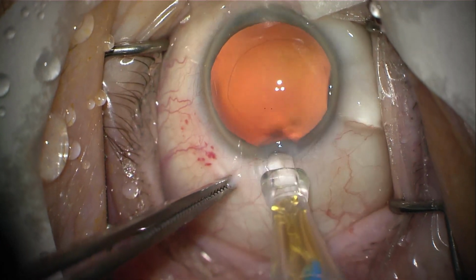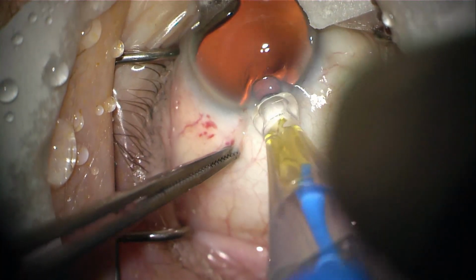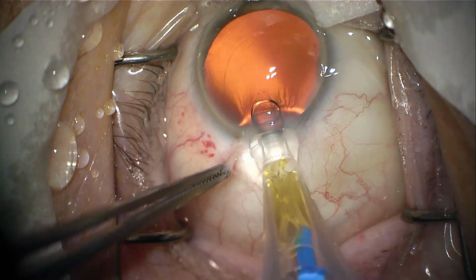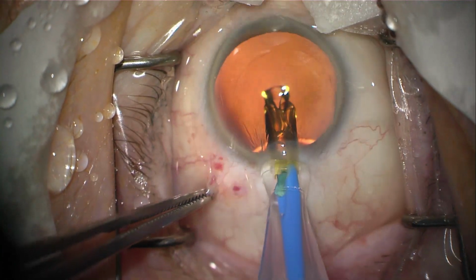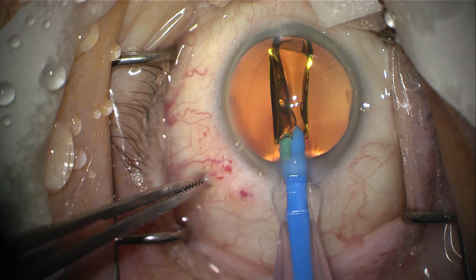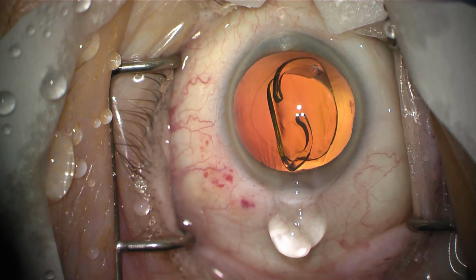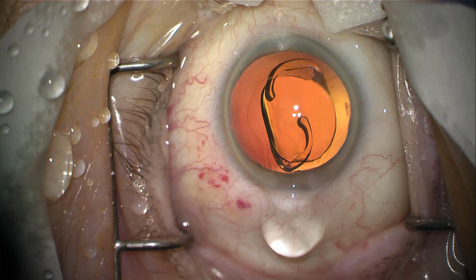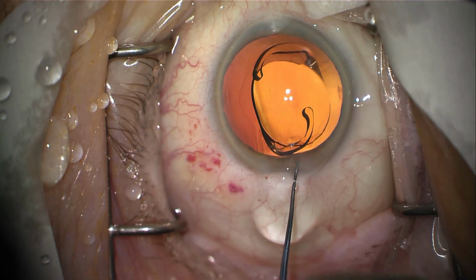I'm now inserting that, which is about 2.4 millimeters, into my original 2.4 millimeter incision. I now press a button, and this lens, which was scrolled up inside this little syringe device, unfolds inside the eyeball in the capsular bag where the M&M chocolate used to be, and it has a memory, so it unfolds.